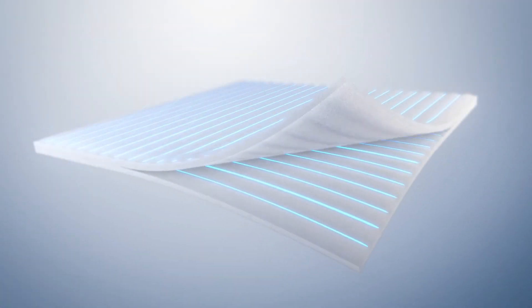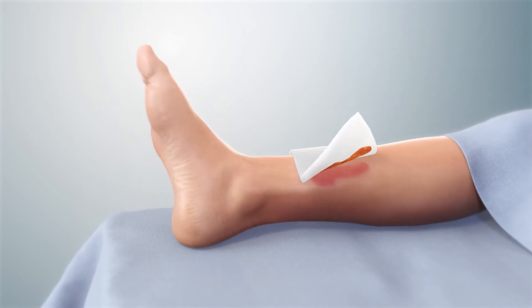Stitching provides extra strength, allowing for safe one-piece removal.